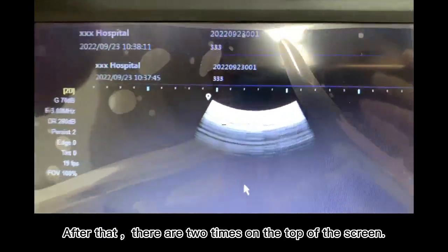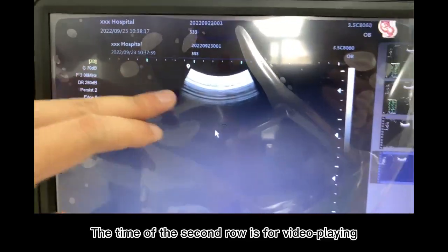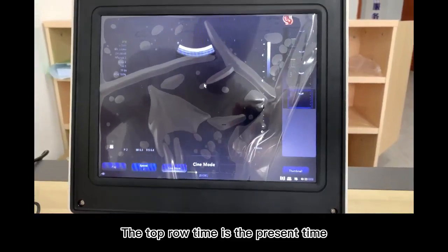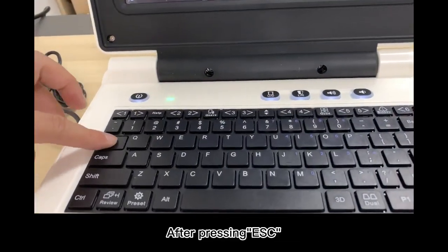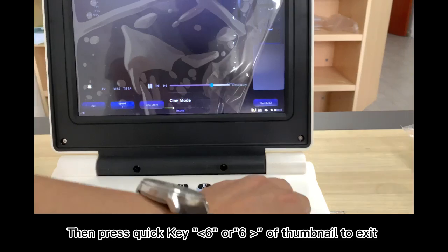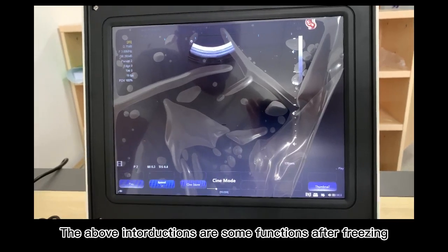After that, there are 2 times on the top of the screen. The time in the second row is for video playing. The top row time is the present time. After pressing ESC, then press quick key 6 of thumbnail to exit. The above introductions are some functions after freezing.